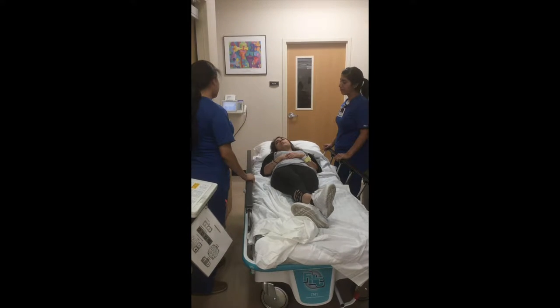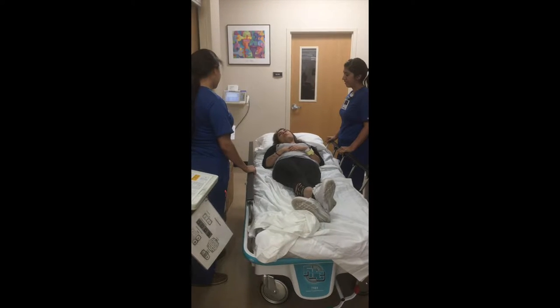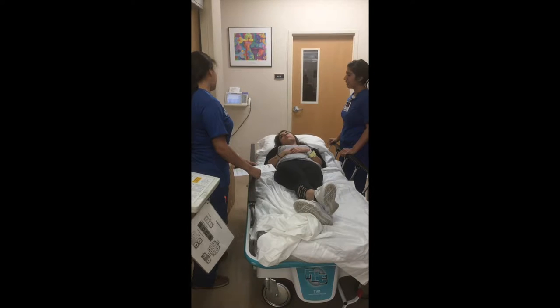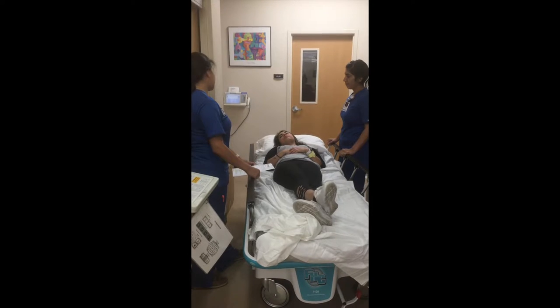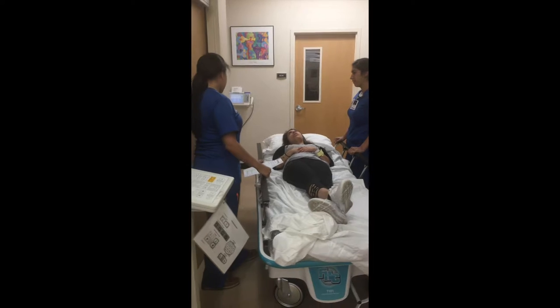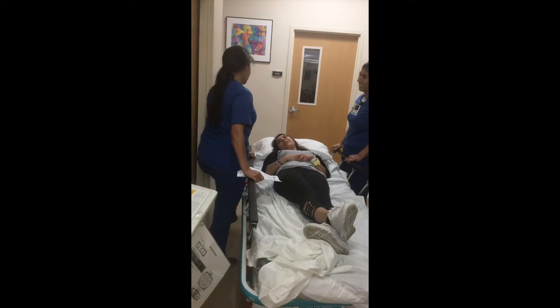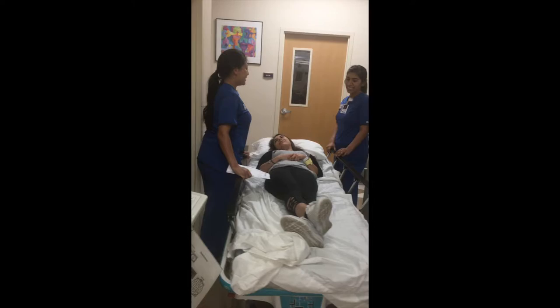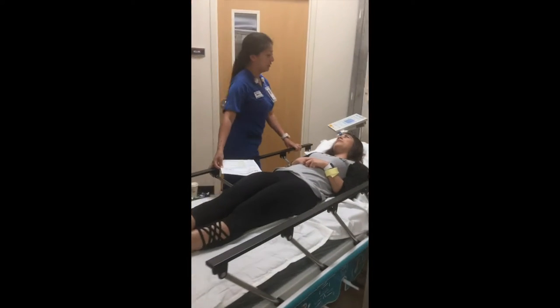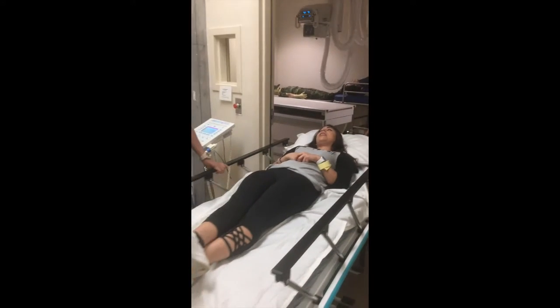Ms. Romero, what's your first name? Gordon. Date of birth? 8-26-95. The doctor ordered a lumbar spine, so we're going to go take those pictures, and your pregnancy test came out negative. So, what brought you in today? I was on my roof and I was taking down Christmas lights and I fell.